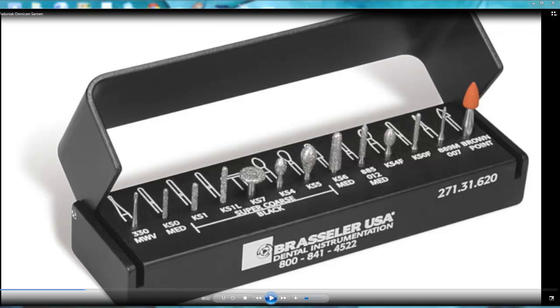For posterior teeth, you see that case one. That's what we're using for posterior teeth. Some other burs I'm going to discuss during the video.